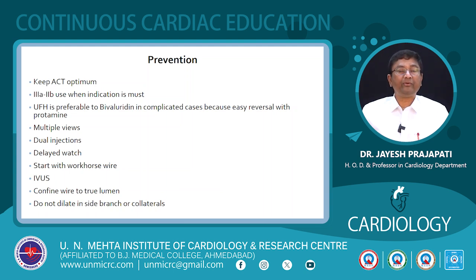Always use multiple views, confirm the wire position. Dual injection is sometimes helpful while doing the CTO. With a CTO, the wire can perforate. So take a dual injection. See whether it is in a true lumen or a false lumen. Delayed watch: during balloon mitral valvotomy, we always watch the apex. Same thing here. Always keep a watch over the tip of the wire. So always keep watch over the apex.